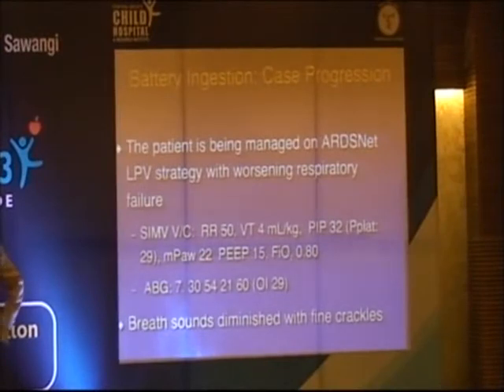Okay, good. So you place the patient. Can you go back? Just to be the devil's advocate and to be fair, you're going to manage this patient now with a mean airway pressure of 27. The mean airway pressure before was, where is it? 22. Next slide. Nope. Whoops. Well, the mean airway pressure was less than 27. 22. So yeah, 22.